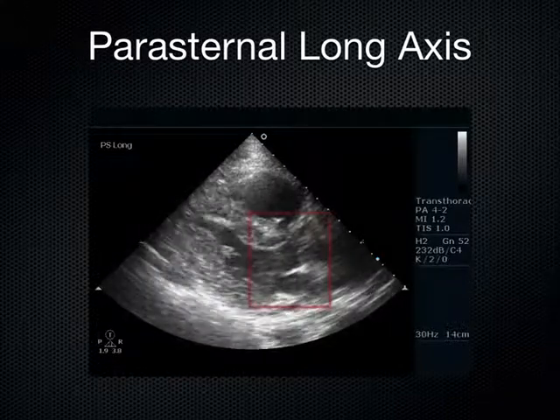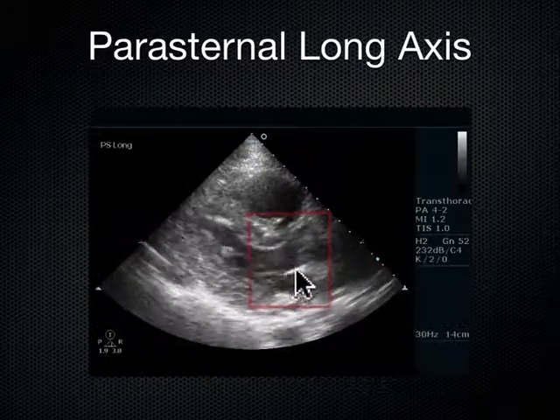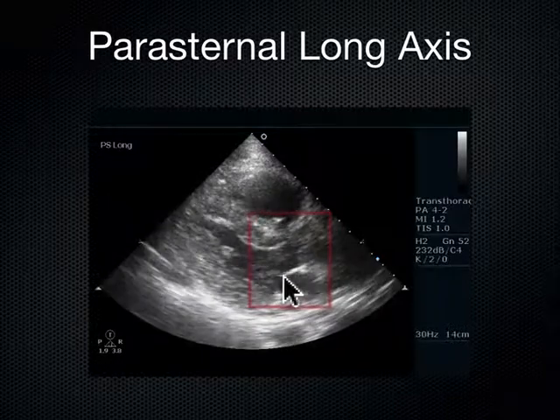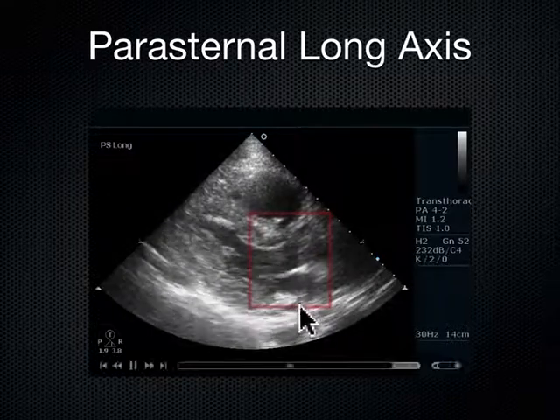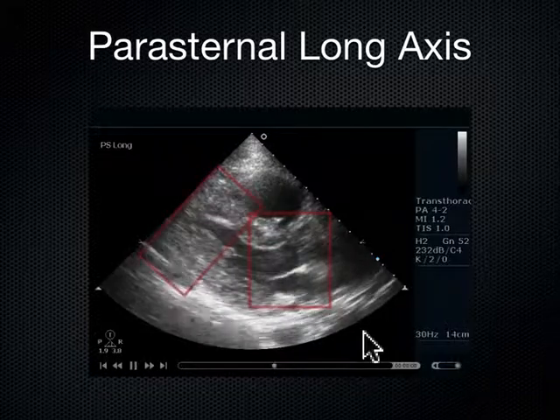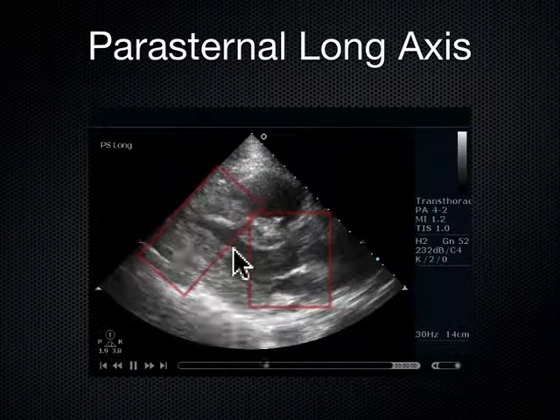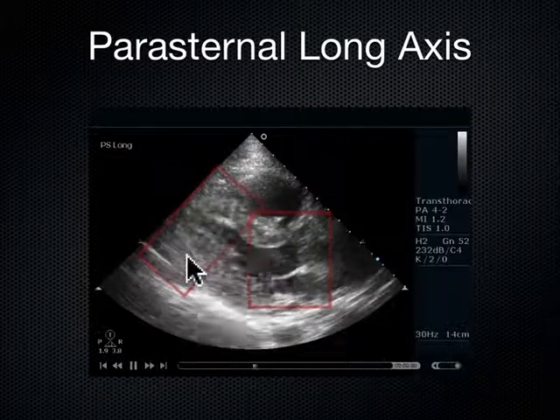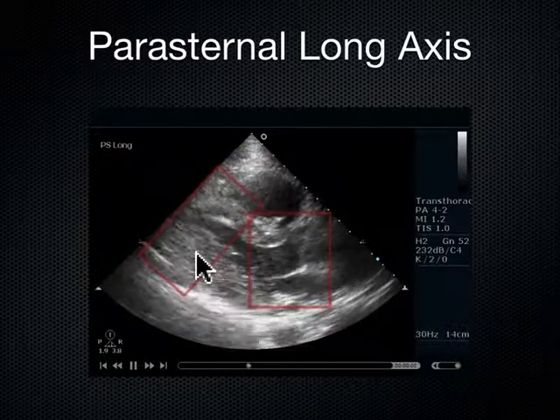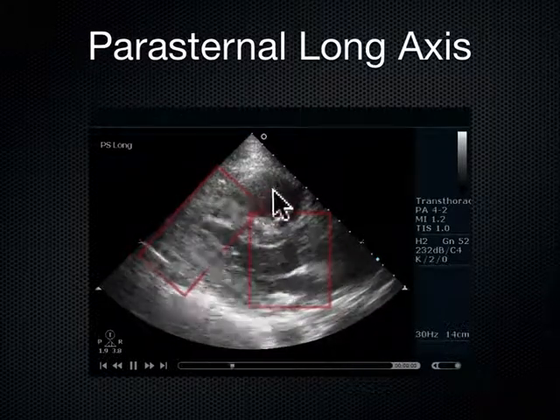So first of all, we've got that mitral valve. The mitral valve is just sort of camping out right here, not doing hardly anything at all. It's almost just fluttering along there, not really making any decent headway towards the septum. Then we look at the chamber size of the left ventricle here, and we see that interventricular septum and that posterior wall not really squeezing together very much. In fact, not really moving at all. Here's another thing I'm noticing. The right ventricle is up here.